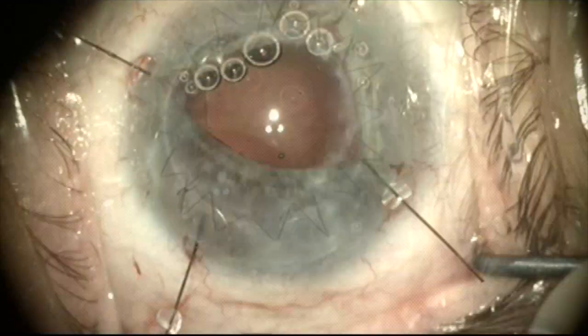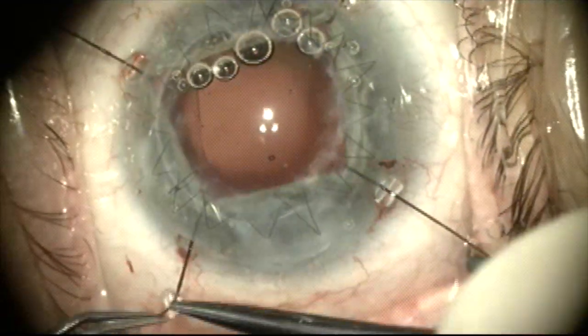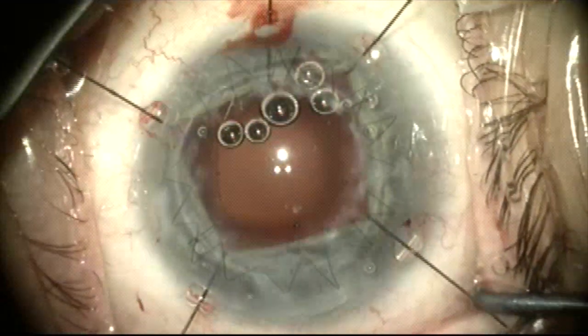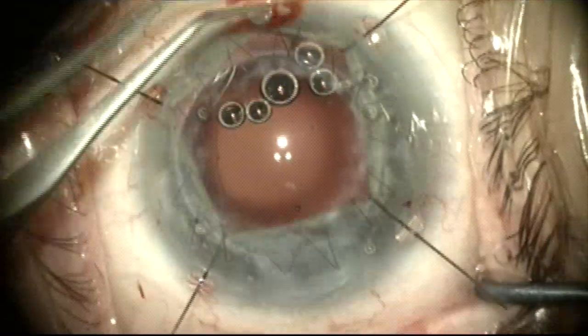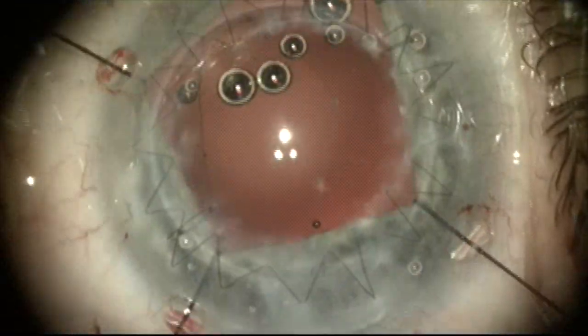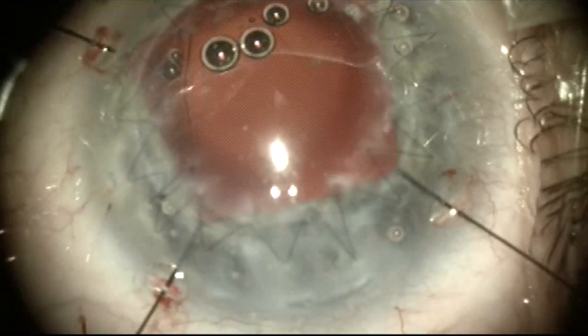On inspecting here you can see the split in the posterior capsule. So I made a decision for better visualization to add iris retractors. And after adding five iris retractors it's clear that there's a posterior capsule tear that has split around anteriorly and created a radial tear coming from posterior to anterior.